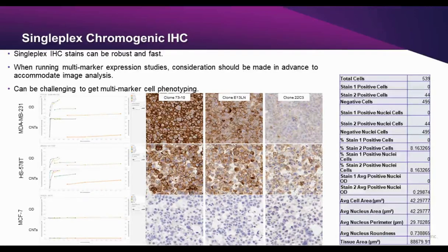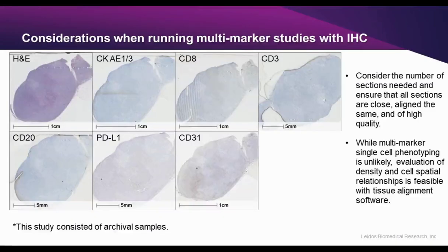While singleplex IHC excels for analyzing a standalone marker, it isn't necessarily the best technology to use when multiple markers need to be considered.